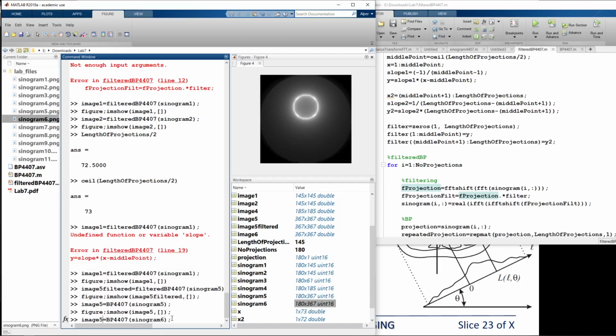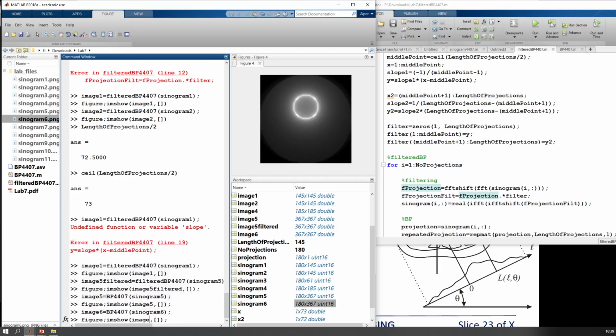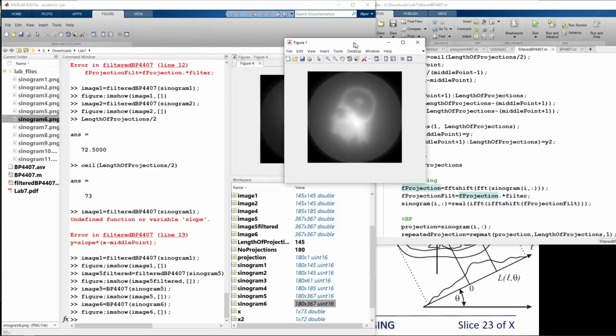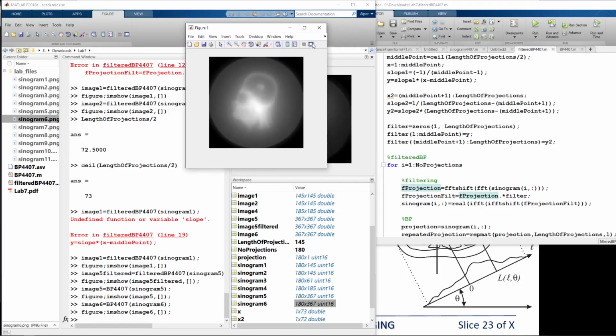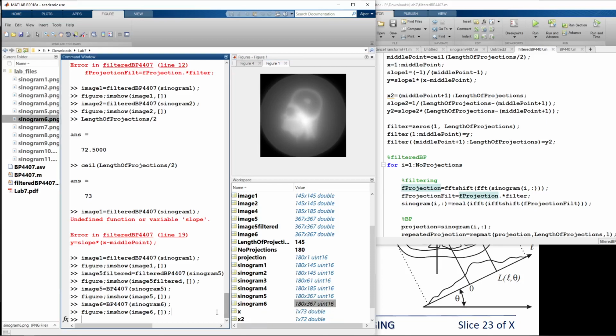Okay, 6. Look at it this way. So here is the Homer Simpson. So here is an image where we can understand what is going wrong in this process. Okay, let's put it here. So the sinogram 6, 367. Let's see what filtered back projection generates.